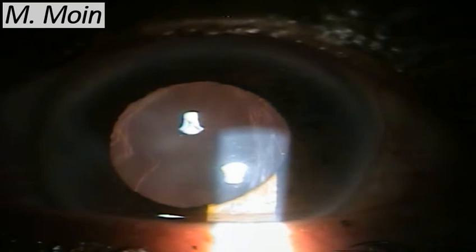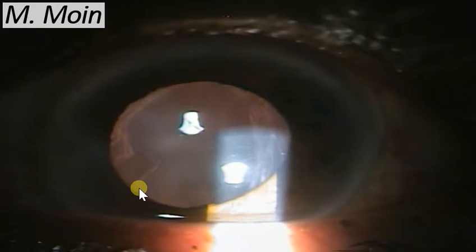Welcome to this video on slit lamp examination. Here we are showing you an anterior segment photograph of a patient with a mid-dilated pupil, and you can see there's some area of capsules over here. So this patient actually had this area of posterior capsular rent, and the IOL had been implanted in the sulcus in this patient.